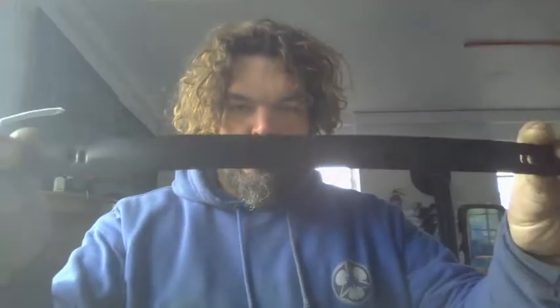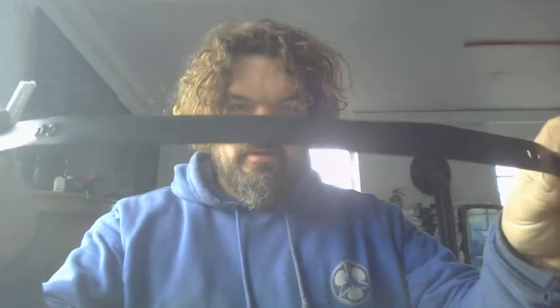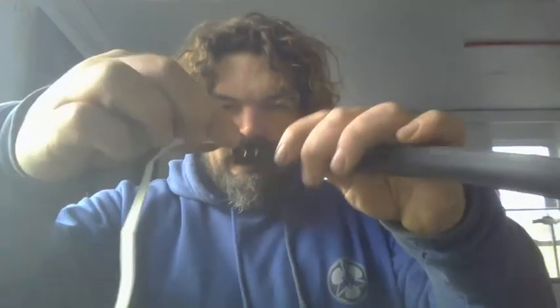I just wanted to show you how to do the attachment of the face shield in case you make it at home. You could use some kind of hard plastic that you cut or even a belt. On one side you need to have three holes and two holes. On the other side you need two holes and two holes. The stripe needs to be inside the plastic so that you have the least possible plastic in contact with your skin.